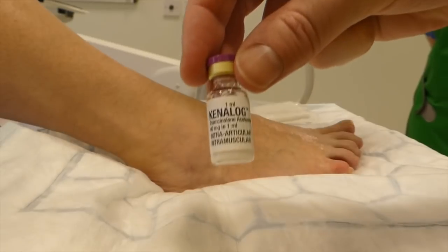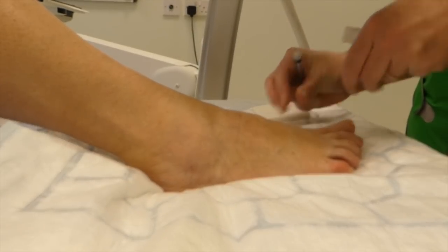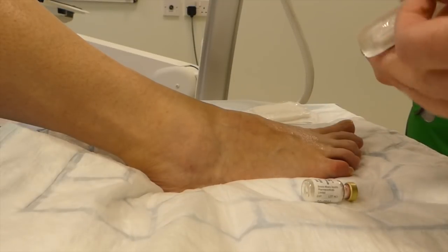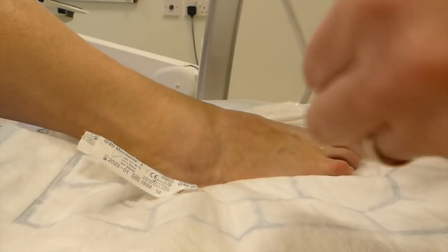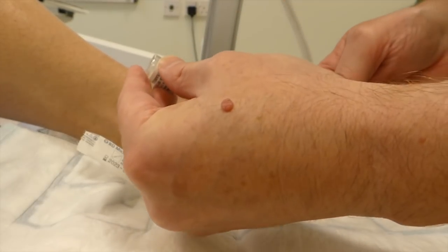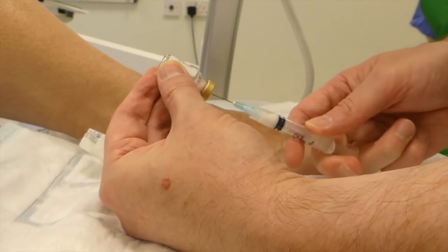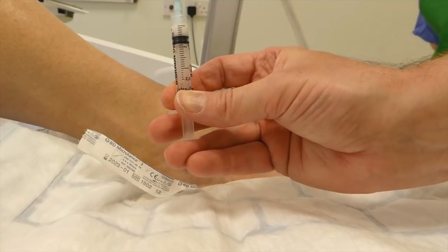So a bit of Kenalog — we love Kenalog in a joint. Triamcinolone, 40 milligrams. Possibly a little bit less for a smaller joint, so anywhere between 20 and 40 milligrams, which is half to one milliliter, is just nice. Give it a little bit of a whizz up, and then we're going to draw up some Kenalog — about half a milliliter will do it.